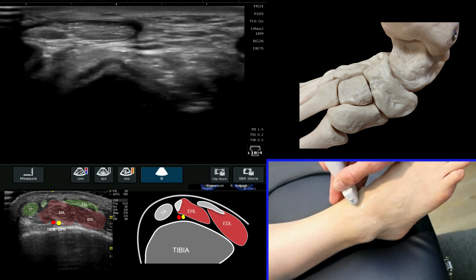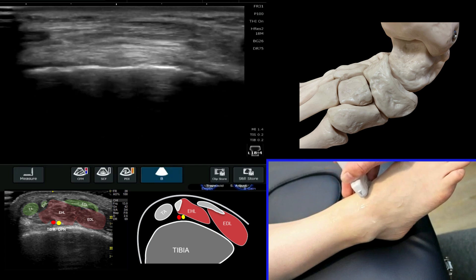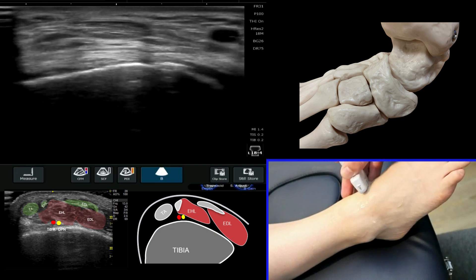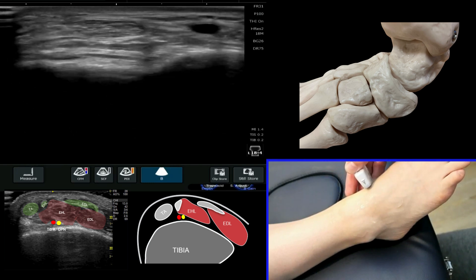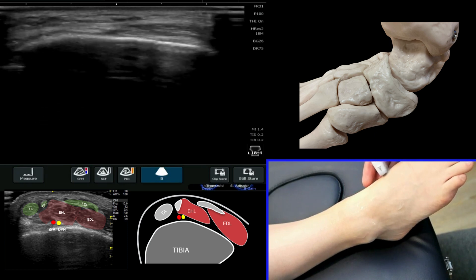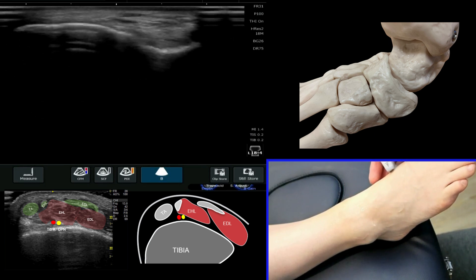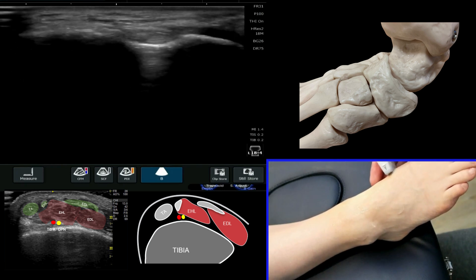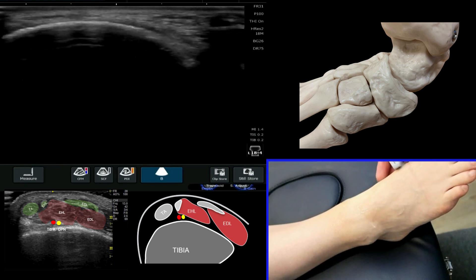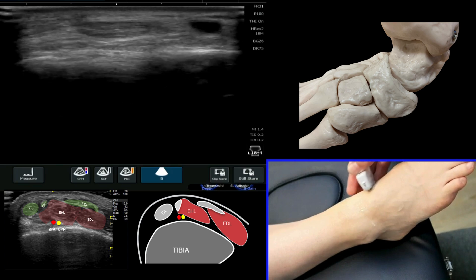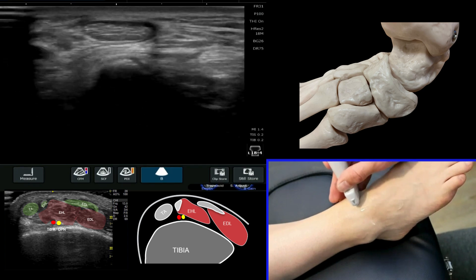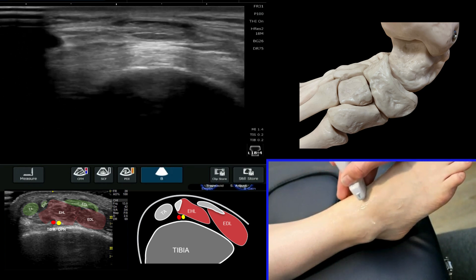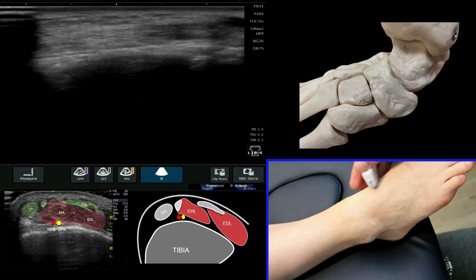If we follow that tendon, we can't come straight down because the course of the tendon is to track slightly more medially over into the region of the medial navicular, and then from the navicular coming down to the medial cuneiform and the first metatarsal. That's how you're going to follow the tibialis anterior tendon more distally.